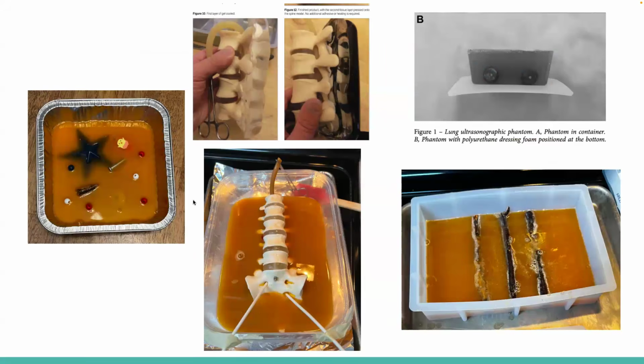These are some examples. This is from a paper for how to do an ultrasound-assisted LP, more with the gelatin model with ballistics gel. And then I think this one was also with gelatin and food coloring. And they used that flexible tubing that you can get at Lowe's or Home Depot, or you can get it in the hospital.